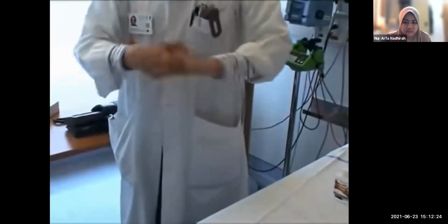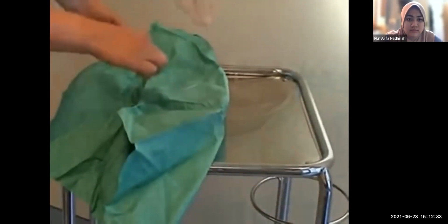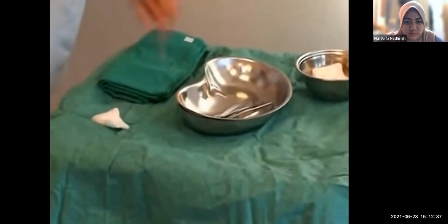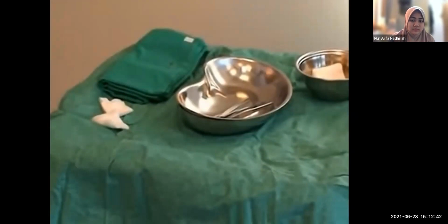Remove gloves. Wash and disinfect your hands. Place your urethral catheterization kit on a tray. Open the inner paper wrapping to form a sterile field. Remove two of the sterile swabs from the cup. One will be used for the application of the lubricant gel on the catheter, and the other will serve to hold the penis during the procedure.